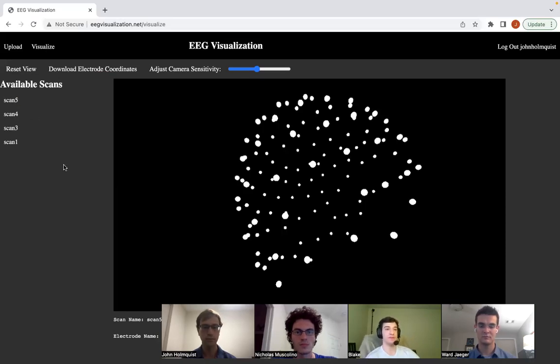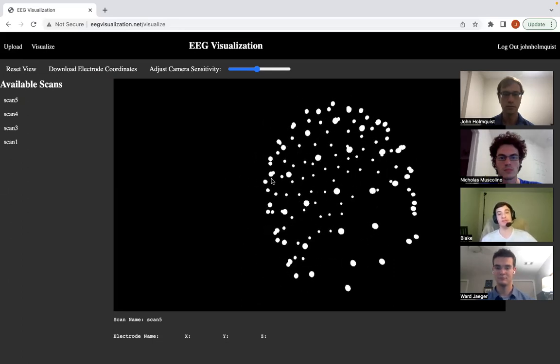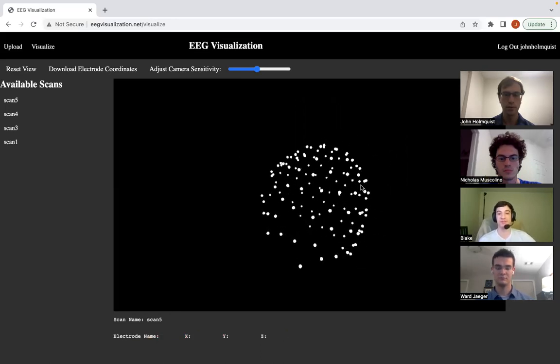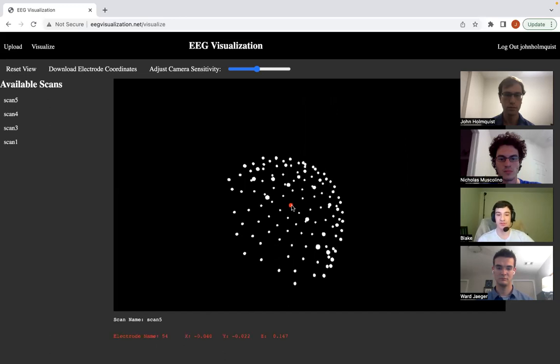Yeah, so more on the visualization page itself. This is where the user can actually see the coordinates of the electrodes in 3D space. They can manipulate the camera by rotating, panning, or zooming. And there's also features that, like if you select a node, it'll tell you what the associated data is with that. So at the bottom there in red, you can see it says electrode name 99 or whatever the name is, and the position value as well.